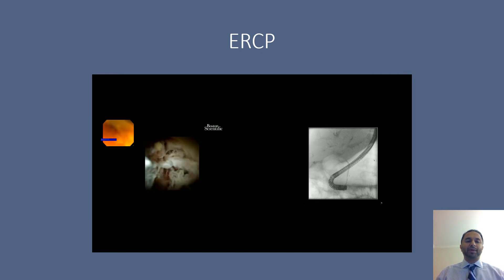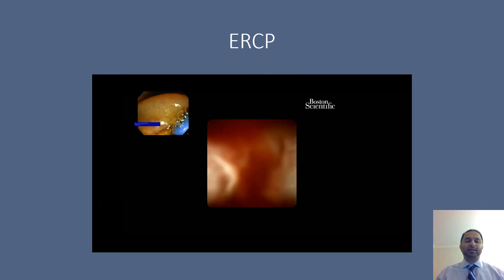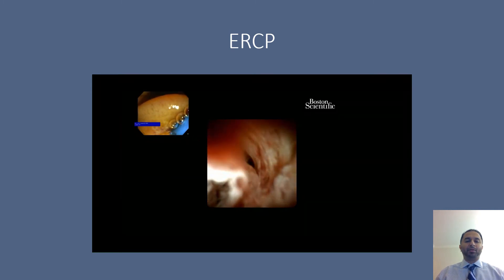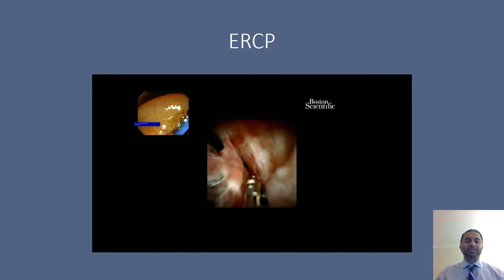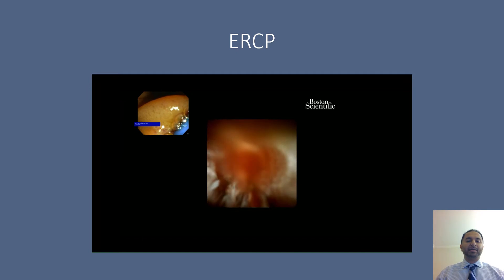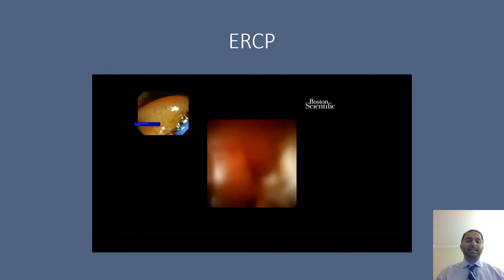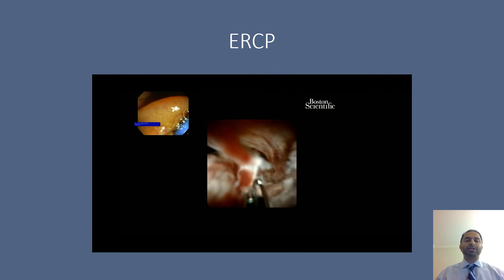We're able to advance the cholangioscope to the hepatic hilum, and we see this intraductal mass, which is very villous-appearing and frond-like. We are then able to advance a small biopsy forcep through the cholangioscope, which is able to be opened and take directed biopsies. This allows us to get better tissue than we normally would if we were to just brush the duct.